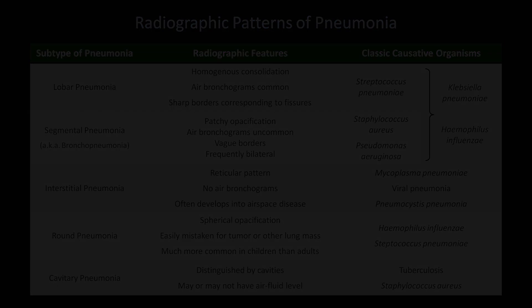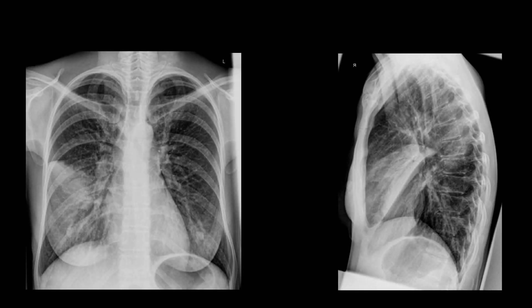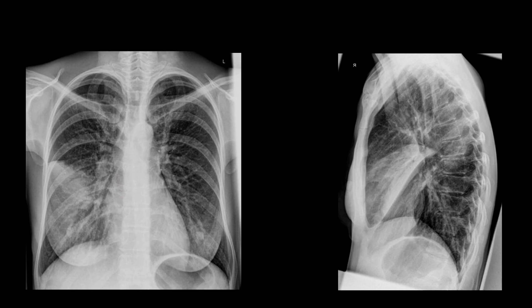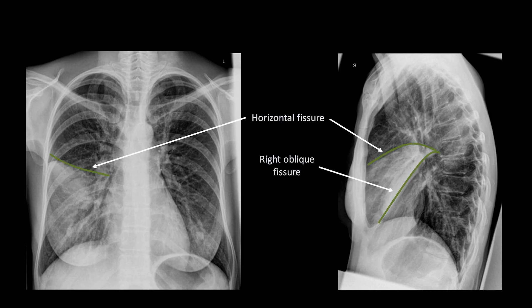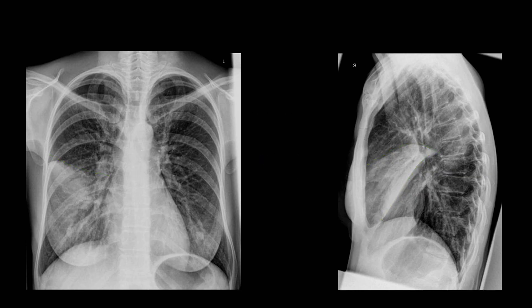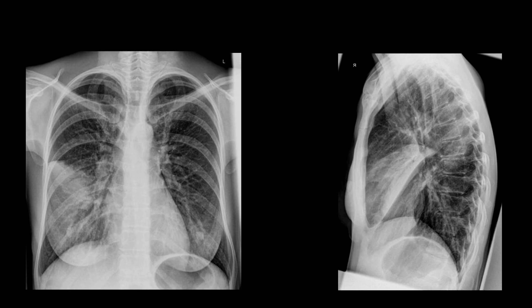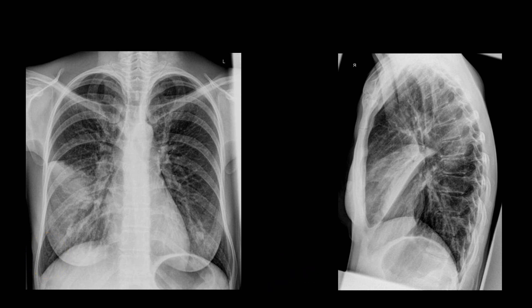Let's apply this to interpret some x-rays of pneumonia. In this example, there is opacification in the right mid and lower lung zones. There is a silhouette sign with the right heart border obscured, suggesting the opacification is in the right middle lobe. We can also see the sharp demarcation between the opacity and normal lung tissue — this border corresponds to the horizontal and right oblique fissures. There is an air bronchogram visible, and the right costophrenic sulcus is clear, suggesting the right lower lobe is not affected. Summary: this is a right middle lobe lobar pneumonia, most likely Streptococcus pneumoniae, but also possibly Klebsiella or Haemophilus influenzae.